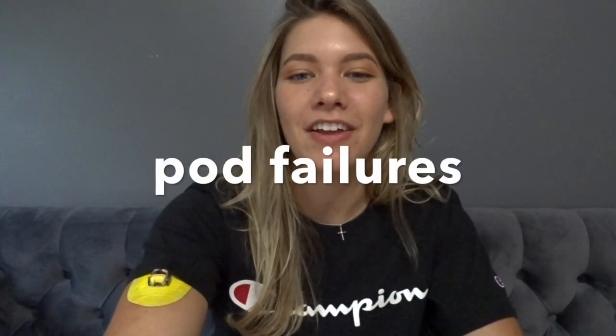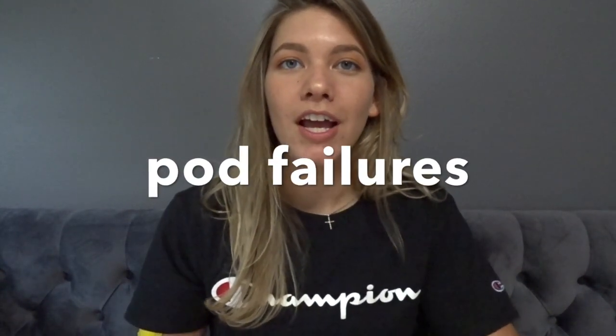Have you had any pod failures because of it? No, and nobody will have pod failures because of Loop. If you have a pod failure, that's just because the pod was bad and it would have happened with your PDM. It'd be like your pod falling off. You can't blame Loop for that. You can't blame your PDM for that. It's just the pod was bad. I've had one pod failure, but it was not because of Loop.